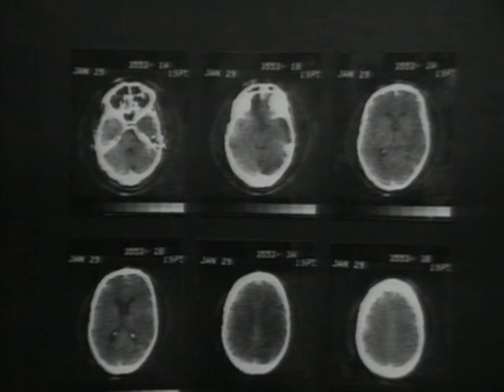As I have mentioned before, structures are identified and their shape, size and position defined. Changes in tissue density are then looked for. Usually a space-occupying lesion will produce a characteristic displacement or deformity of some part of the ventricular system, but for precise identification, the extent of tissue change needs to be defined.